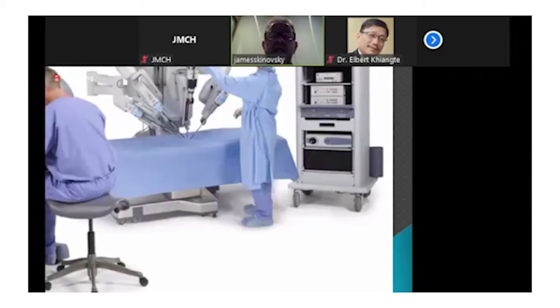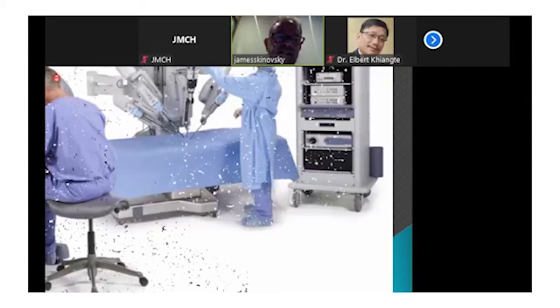This is the Da Vinci as we work with it nowadays. All of us, just observing this image, can assume that it is quite big. It's a little bit difficult to move the platform inside the operation room. And in this platform, as we can observe here, the surgeon has a completely immersive experience. So the interface between the surgeon, the surgical staff, and the patient is a little bit complicated, and we are going to observe that the new platforms are changing these expectations very fast.